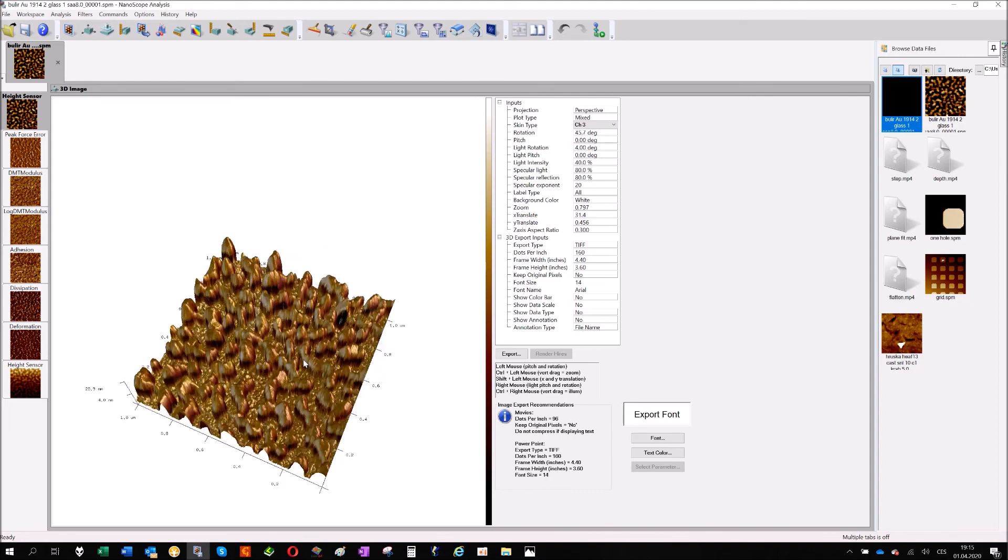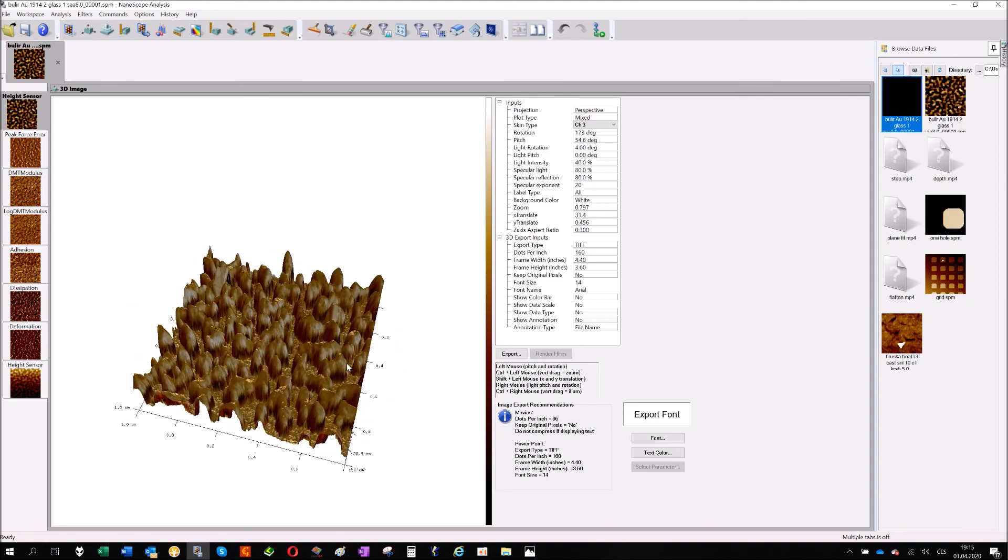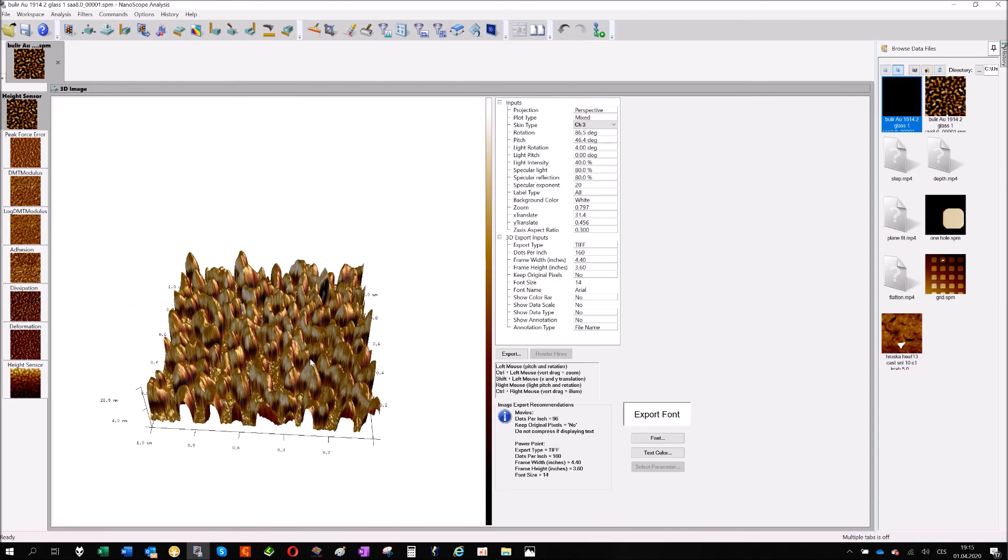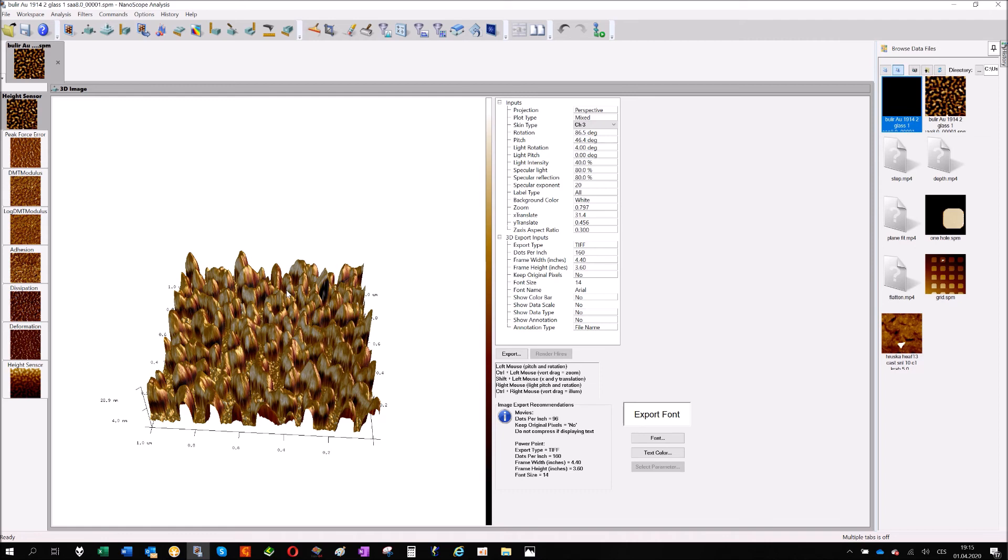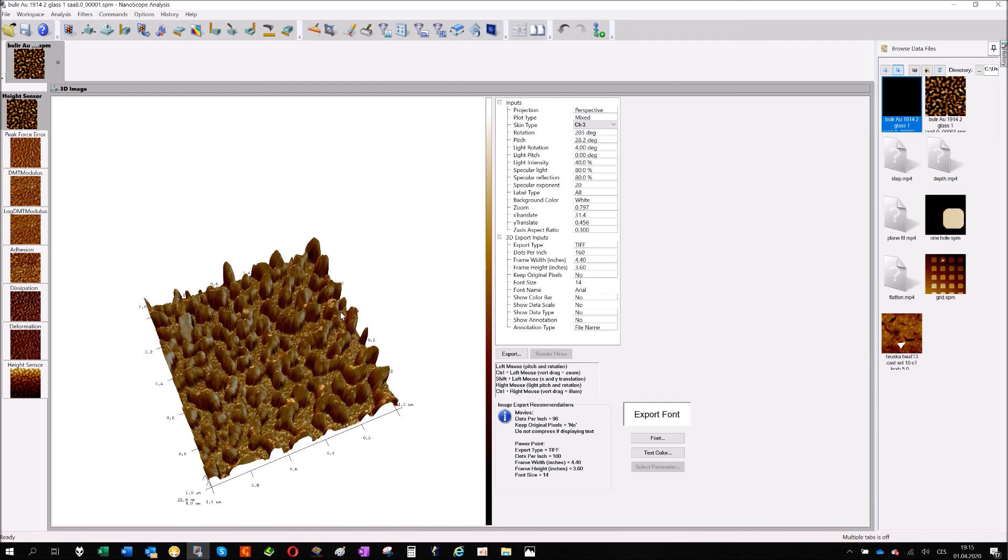So at the same moment we have two information in one picture: the morphology or topography which corresponds with the topography, and the information about mechanics which is in the color of the image. So that's it.